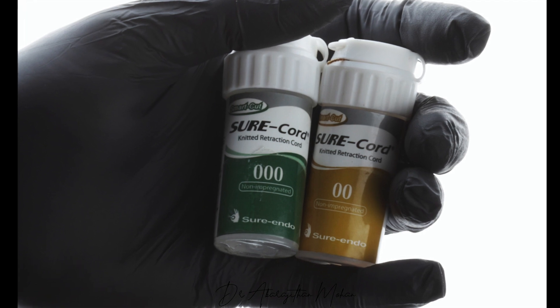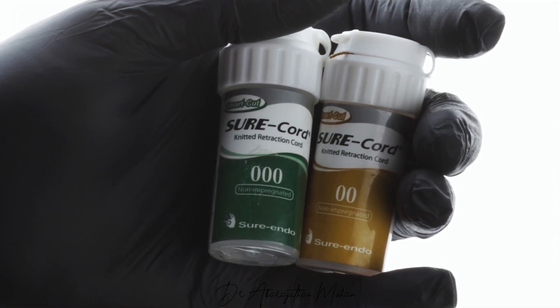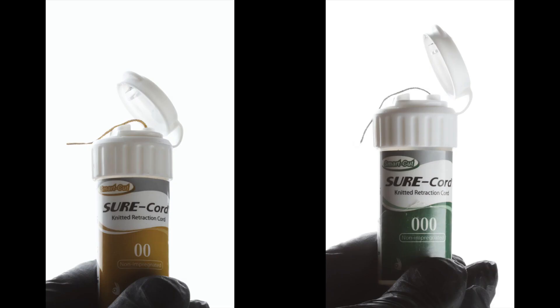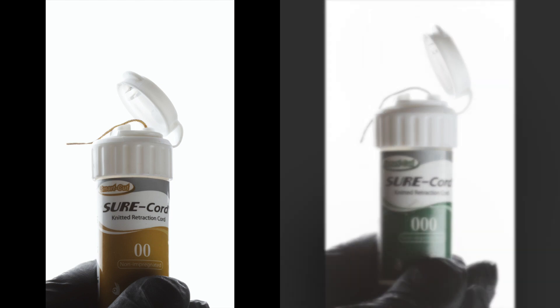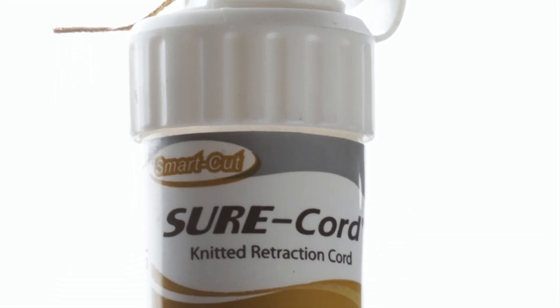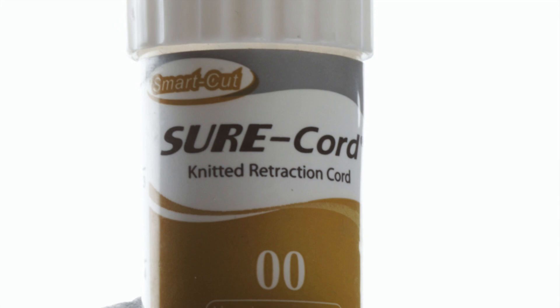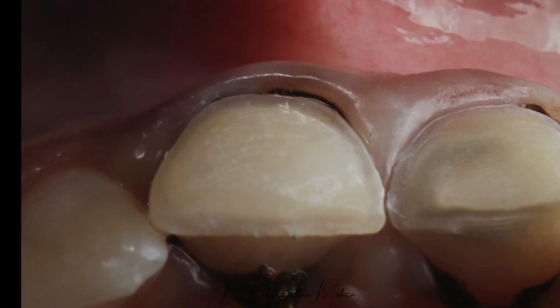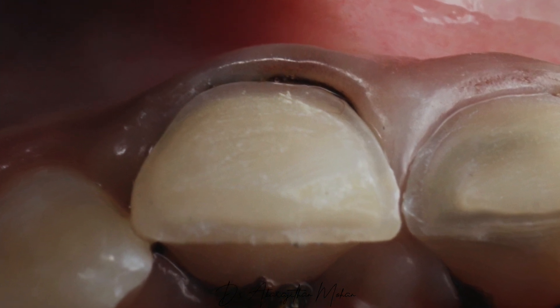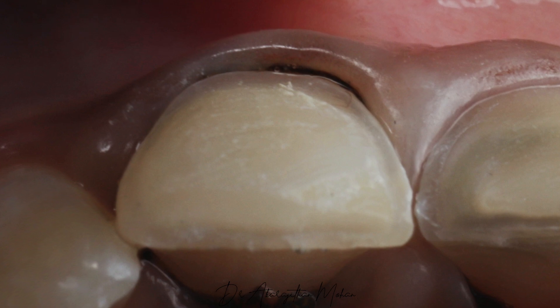The most commonly used cord sizes are triple zero and double zero. Double zero is a little thicker and triple zero is thinner. Generally if you want more lateral displacement of the gingiva, it's preferable to go for a double zero, whereas if you do not want much lateral displacement you can go for a triple zero, as in the case of luting, bonding, or restoration. Here, since I want more lateral displacement to protect the gingiva during my preparation, I have chosen a double zero retraction cord.